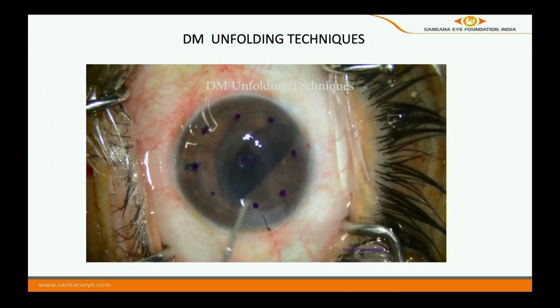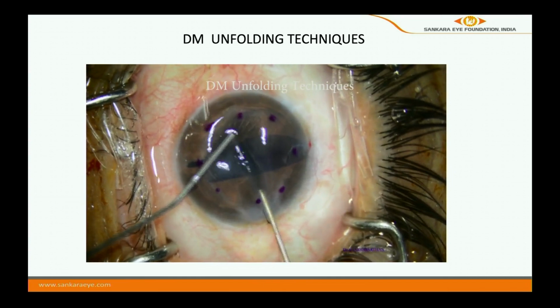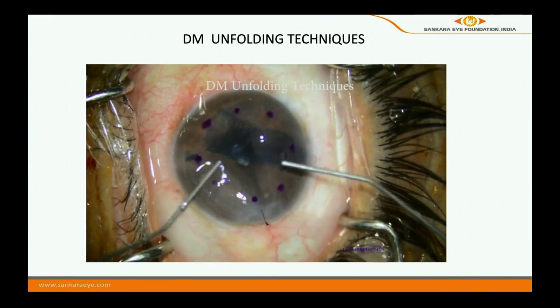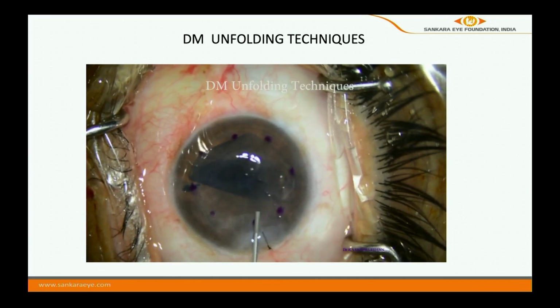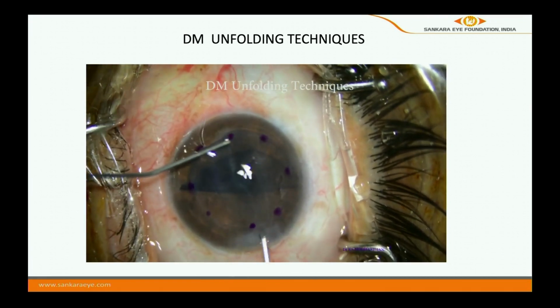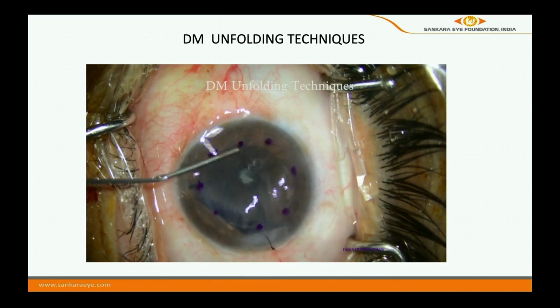So nowadays what I do is this technique. Here I am again doing the same thing, trying to inject saline, and I am trying to rotate it, and then I am trying to tap it like how I did before, but it doesn't always open. So what do you do? The simplest technique which we have evolved is, hold with your left hand, inject saline, shallow it, inject saline, shallow it, inject saline, shallow it, and it opens.